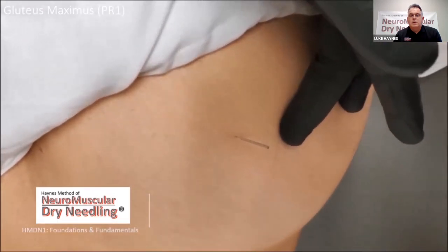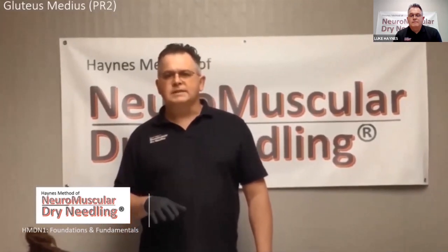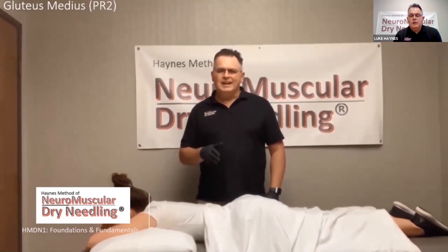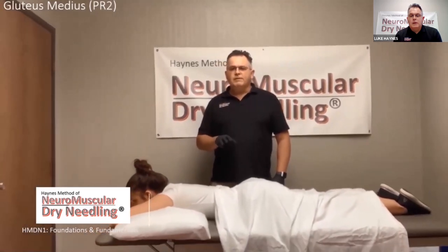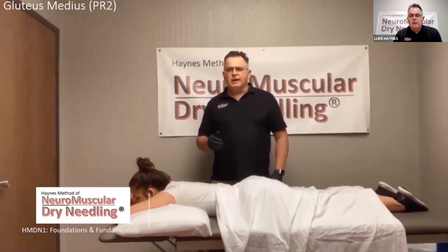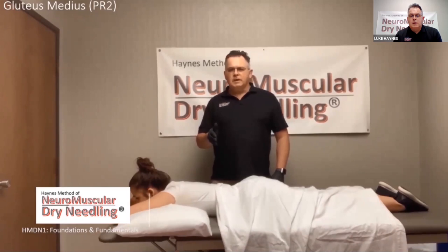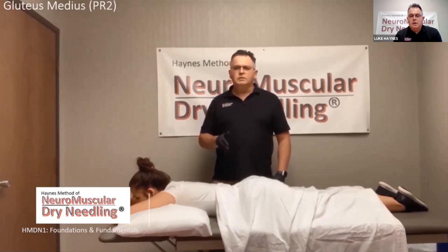For the gluteus medius, the patient is going to be in the prone position. Needle length here is going to be 40 to 60 millimeters. The backdrop is going to be onto the ilium. We're going to palpate for the iliotibial band superior to the greater trochanter to the iliac crest. We're going to move 3 finger breadths posterior on the iliac crest, and then insert the needle 2 to 4 finger breadths inferior from the iliac crest into the muscle with an angulation into the muscle perpendicular to and using ilium as a backdrop.